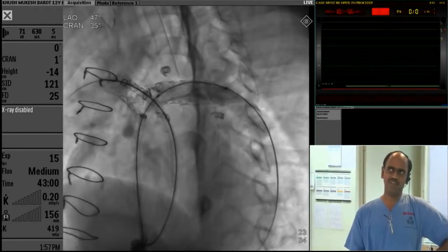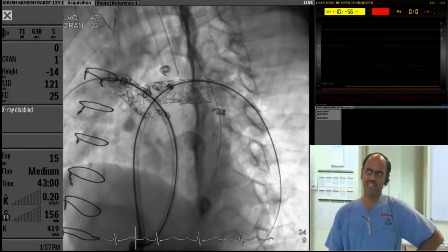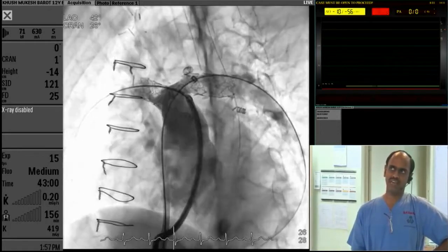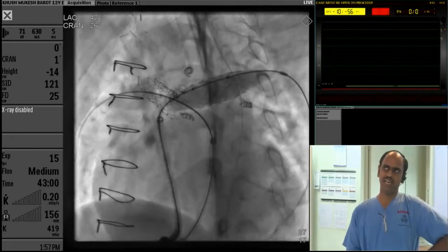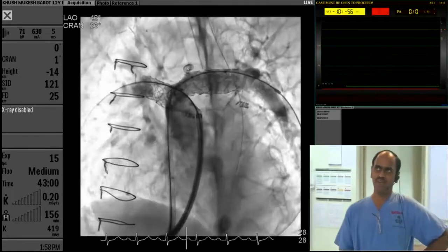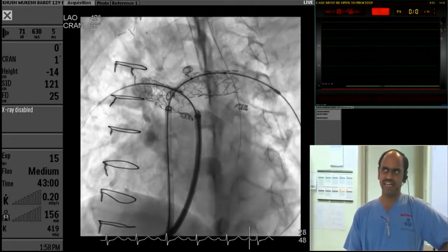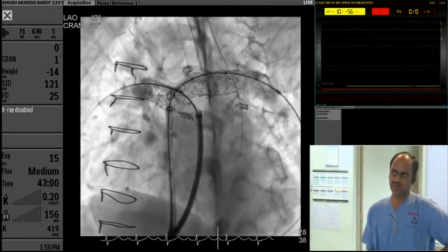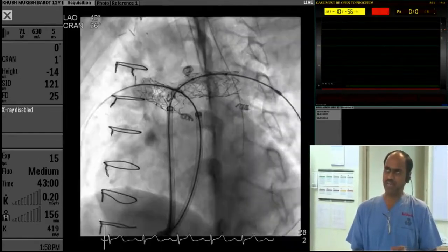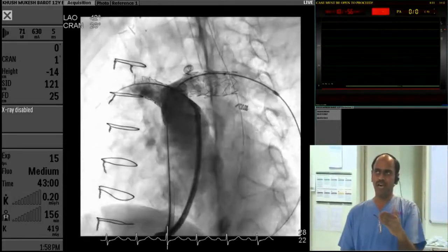After that, we found that the left pulmonary artery was looking a little small at the ostial area. So we decided to post-dilate it. We post-dilated with a 14 Atlas balloon, and at the end we had a reasonable opening of the right and left pulmonary arteries with a 10-10 gradient across. The right ventricular systolic pressure was around 60. The right and left pulmonary artery pressures were around 40.